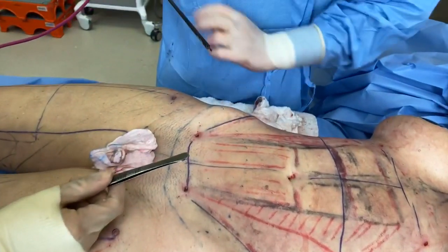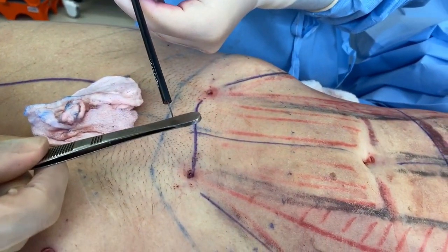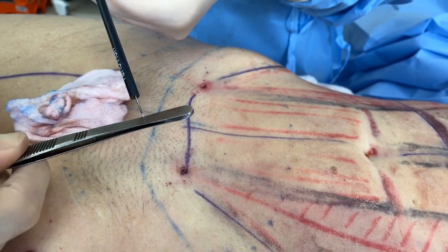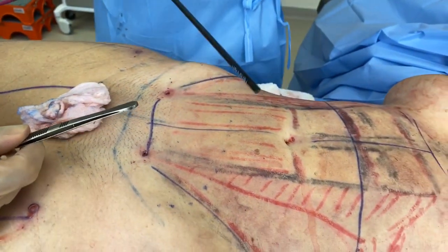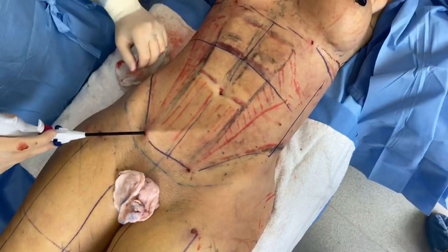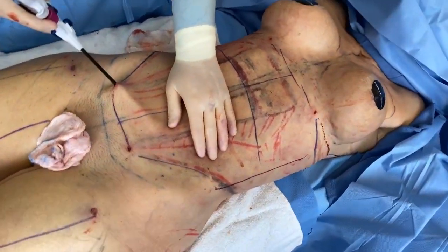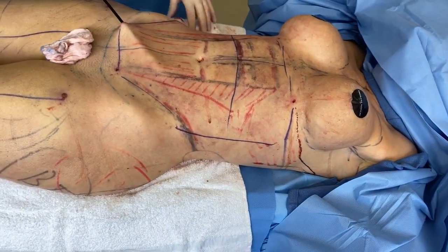Every so often we have to clean this, so we open it up and I can show you guys the plasma flame. That's what's going on underneath the skin at 360 degrees — literally going under there grabbing the tissue and tightening it. How do you know how many passes to do? Experience, based on clinical trials.